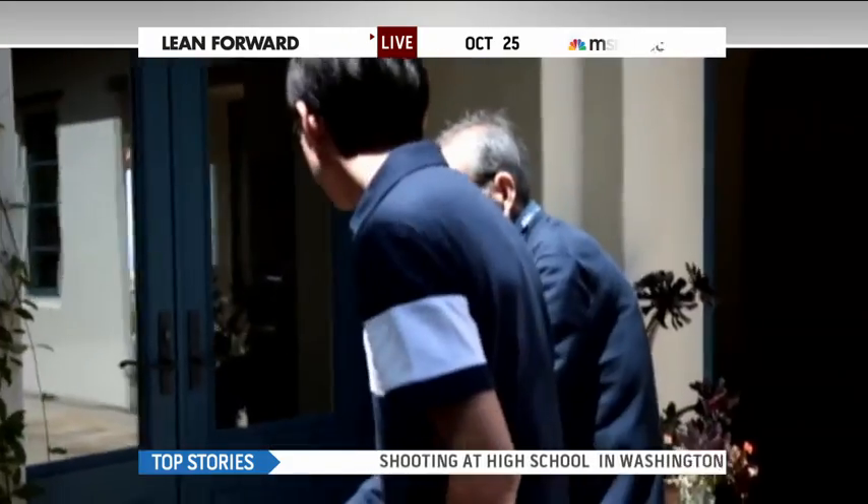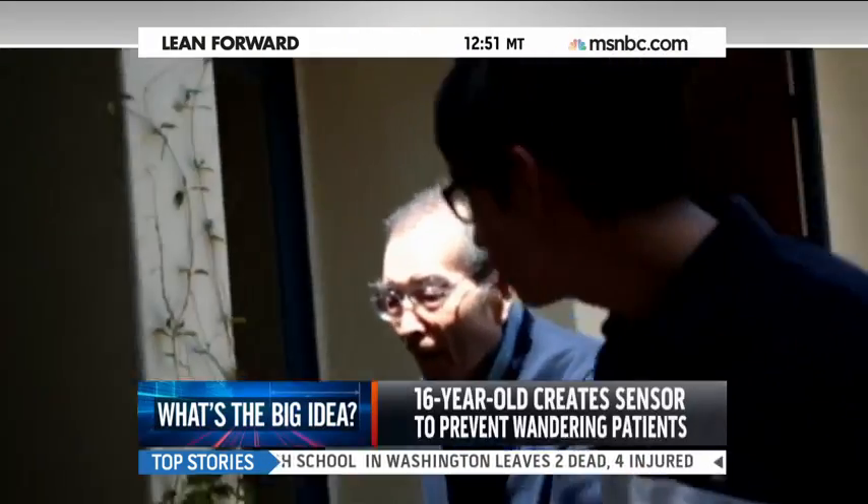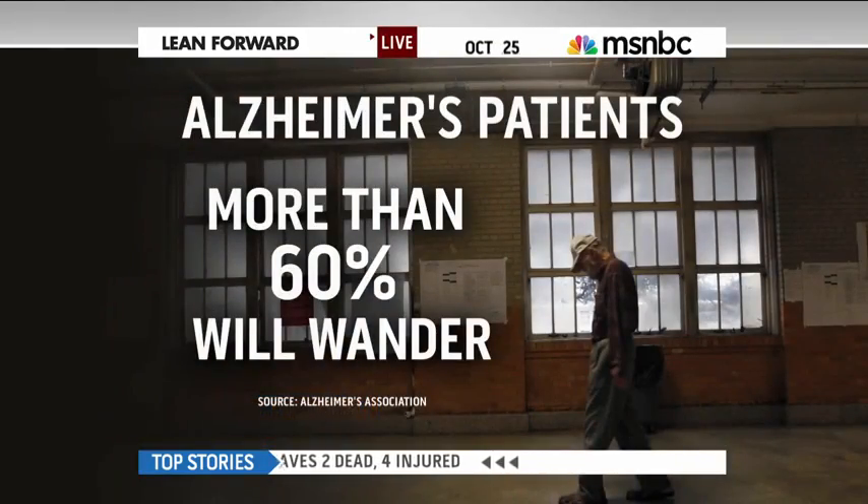A sensor on an Alzheimer's patient's foot that could prevent them from wandering — it's today's big idea. 16-year-old Kenneth Shinozuka developed it to help his grandfather, an Alzheimer's patient who has wandered away from home. It's a problem that affects more than 60% of Alzheimer's patients.